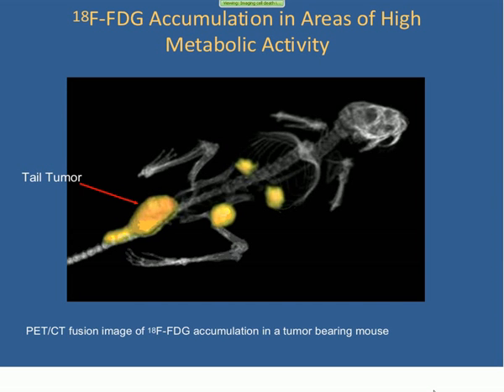And the beautiful thing about this probe is that when it's internalized, it's then phosphorylated, thus trapping the FDG within the cell. So things like the heart and brain, which of course are using a lot of sugar in their native state, but also things like tumors, which are undergoing cell division and thus require a lot of energy, as well as inflammatory lesions.